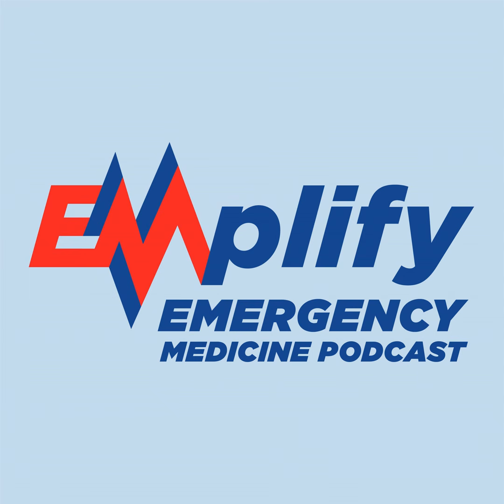There is a trial that looked at slightly higher tidal volumes if you don't have ARDS. So let's say you get intubated due to a brain injury or DKA or things like that. And there was a comparison of about 6 milliliters per kilogram to 8 milliliters per kilogram, and there was really no difference. So if you don't have ARDS, choosing somewhere between 6 and 8 milliliters per kilogram is reasonable. If you do have ARDS, or acute respiratory distress syndrome, then you should probably choose 6 milliliters per kilogram to start. And then you may have to vary your tidal volume based on the patient's plateau pressures, but that's going to be something that we're probably going to have to talk about in depth a little bit later.